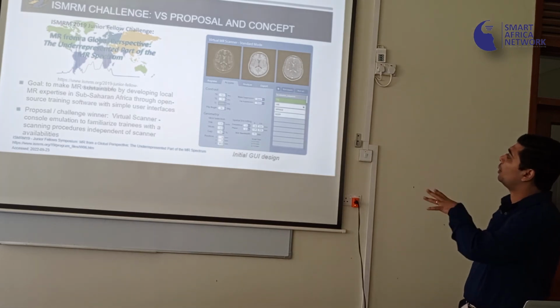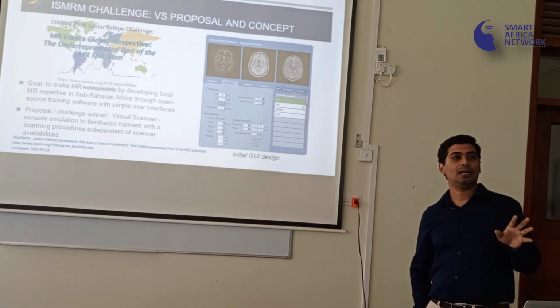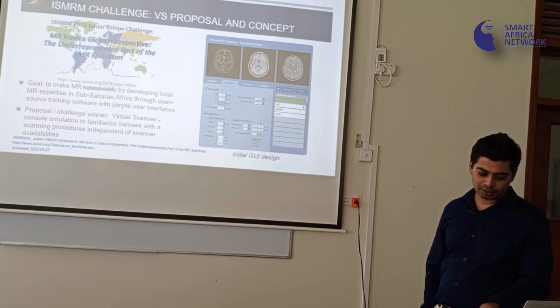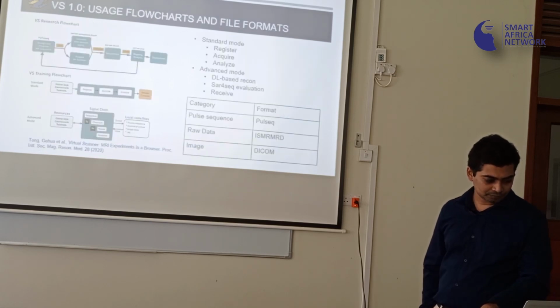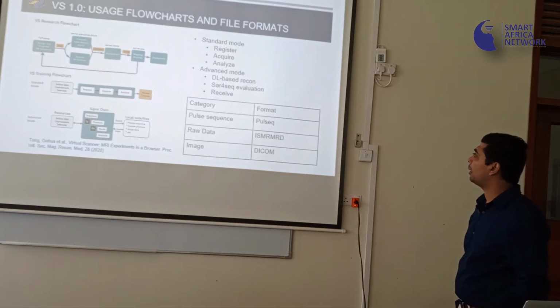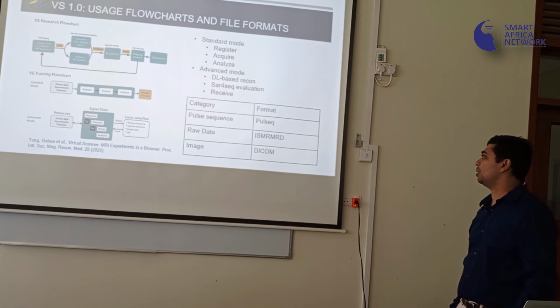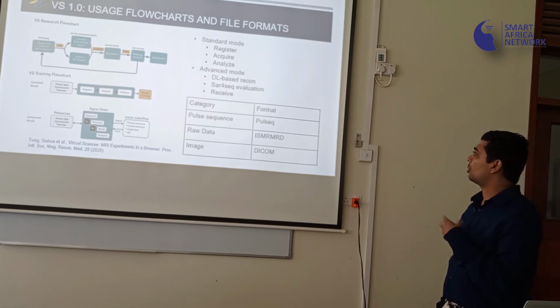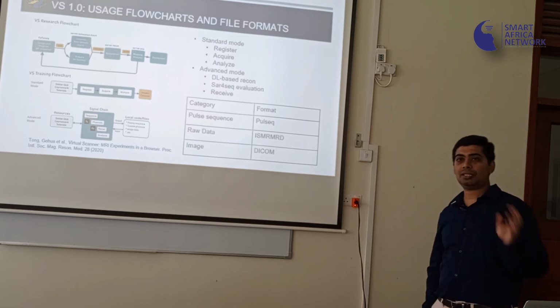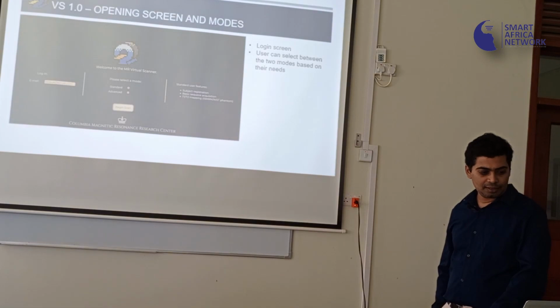This is how the UI looks, similar to how the user interface would look on a clinical scanning console. It has a bunch of components in there for you to look at. Like I said, you can do acquisition, you can do reconstruction, you can also pass images back and forth, you can test out your signal chain, RF transmit and receive.